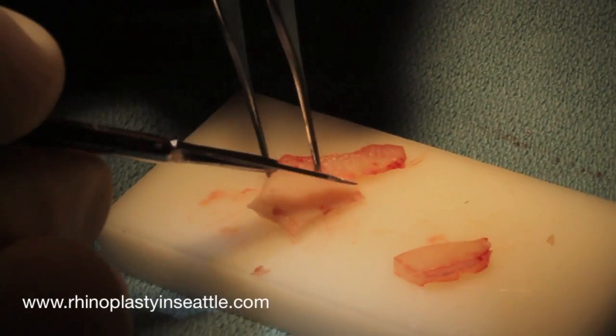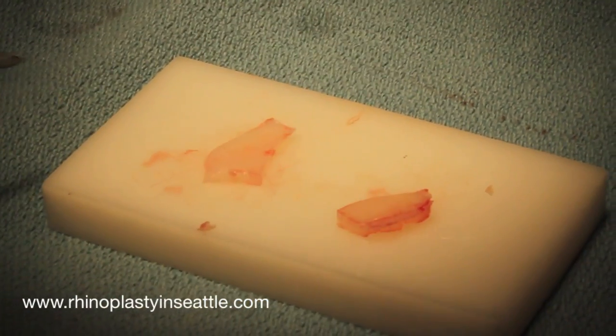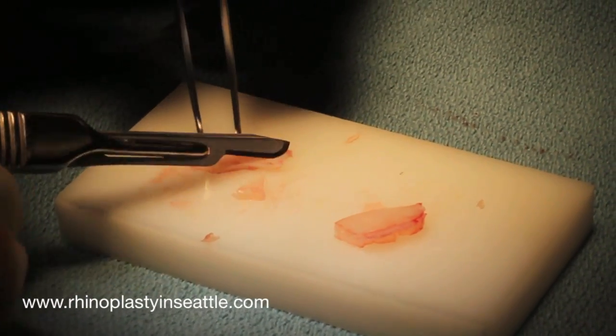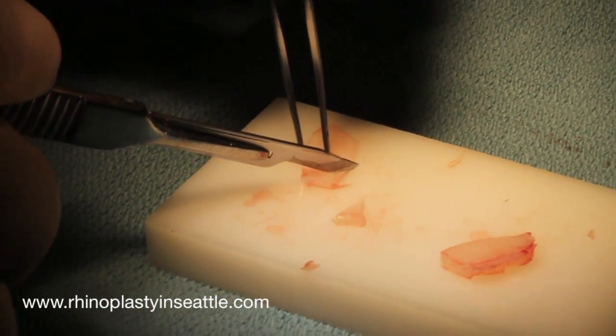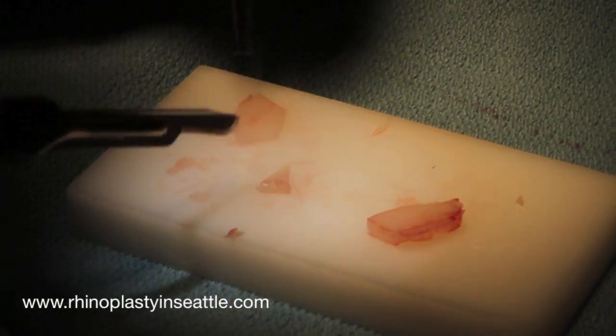People often wonder how you decide what size to make the graft. This is typically done in real time during the case, where I'll measure the actual size of the external nasal valve weakness on the patient, and I'll then translate that to the actual dimensions of the graft that I'm making.